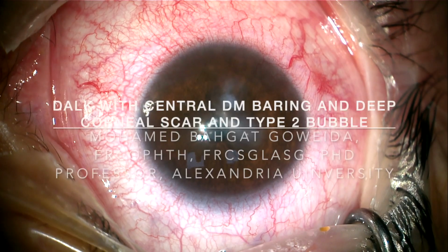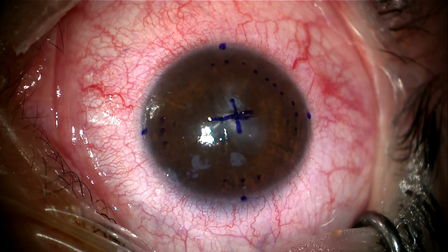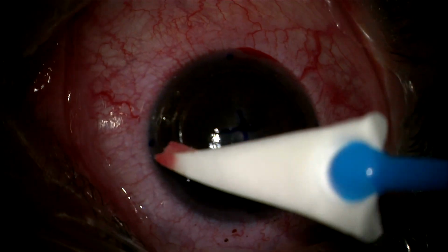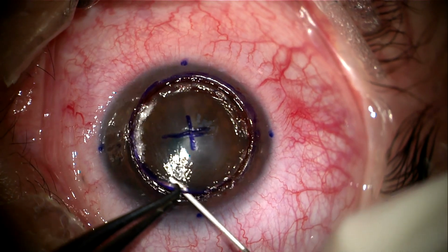Hello everybody, this video will present deep anterior lamellar keratoplasty in post-microbial corneal scar. This case has a deep corneal scar reaching to near Descemet membrane and probably affecting the predescemetic layer.